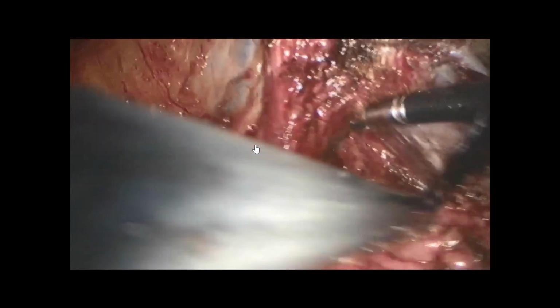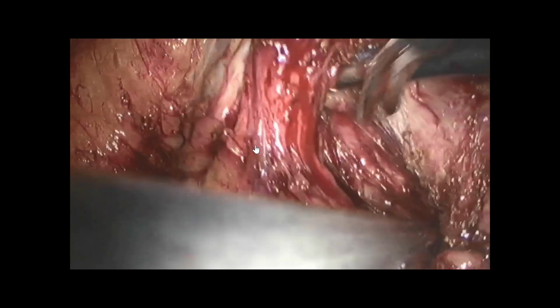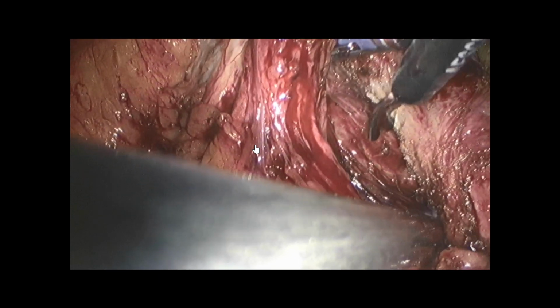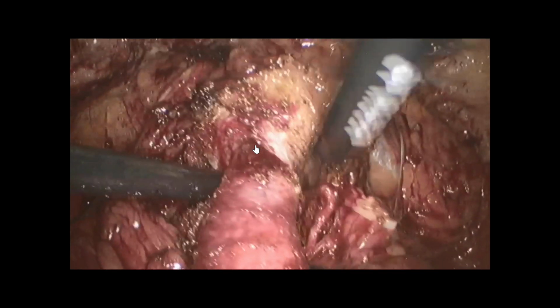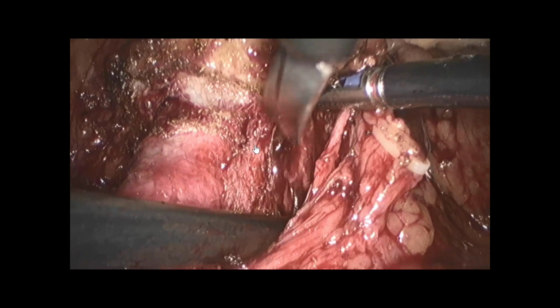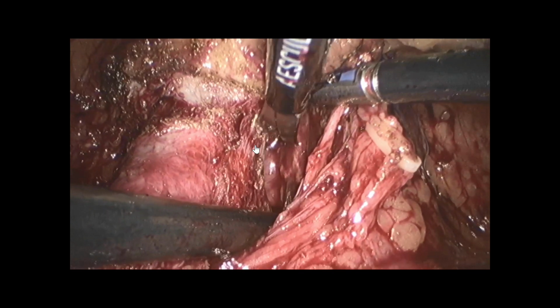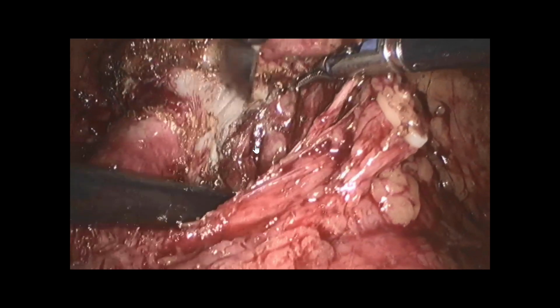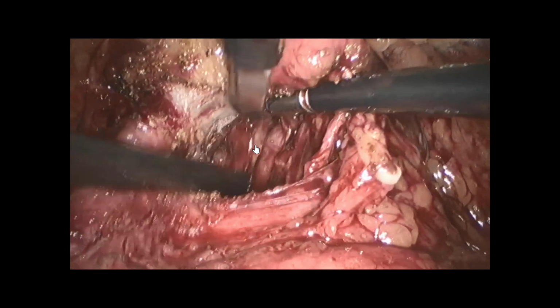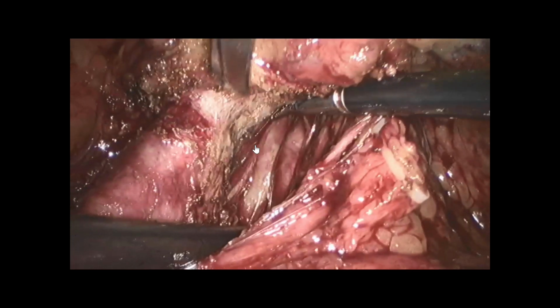When you have a median lobe, or a previous TURP, then I will start medially. I will open the bladder, take the median lobe medially, and I will open the posterior aspect and finish. But then you have a large bladder neck. If I can, I will always try to spare it. And even with a median lobe, you can spare the bladder neck by retraction.